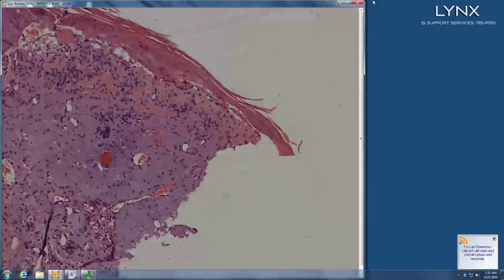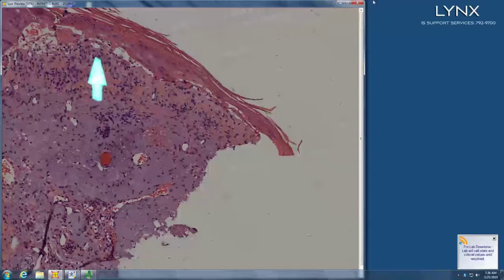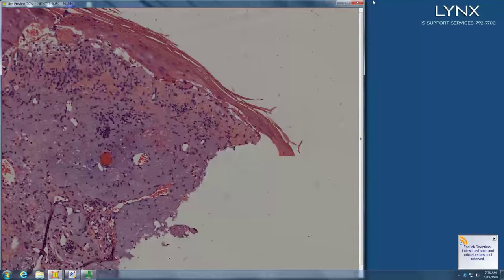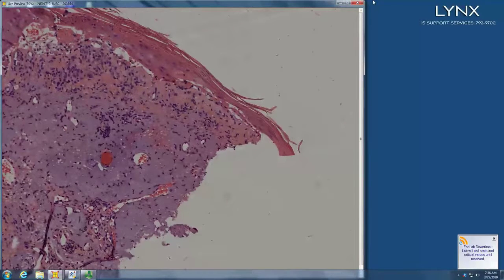The dermis is pretty blue-gray, it looks like. So how old do you think your patient is? Pretty old. Lots of solar elastosis. So some interface, and what kind? Is your basal layer intact, or is the basal layer gone, squamatized? Layers gone. So what kind of interface then? Yeah, lichenoid interface.